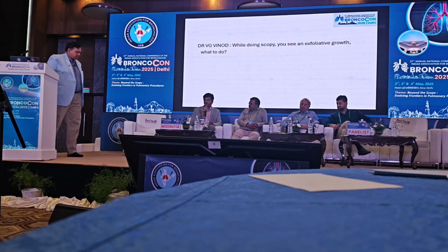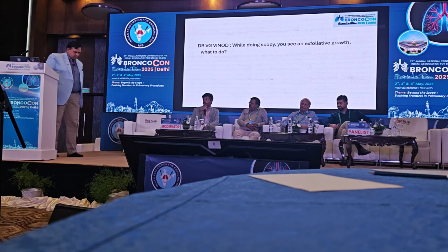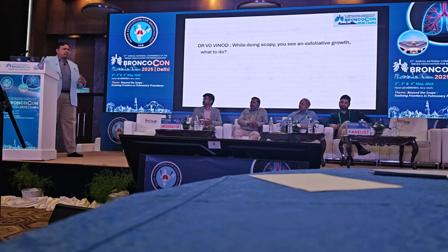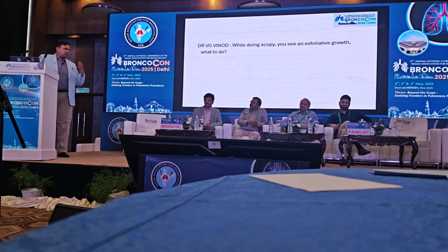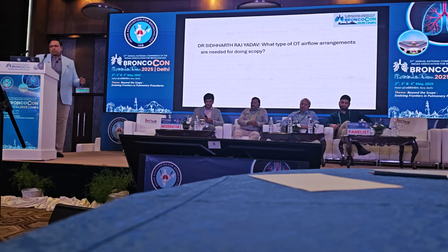So with any growth, obviously we need to be sure that enough planning is there. We need a CT, we need an understanding of the extent of the disease and how vascular it is. And do we have all the tools to go in and retrieve it safely? A simple thing nowadays is that CT and virtual bronchoscopy are also helpful. But if you see the growth, always think of biopsy first and send it in the proper place so that the measurement is done properly.